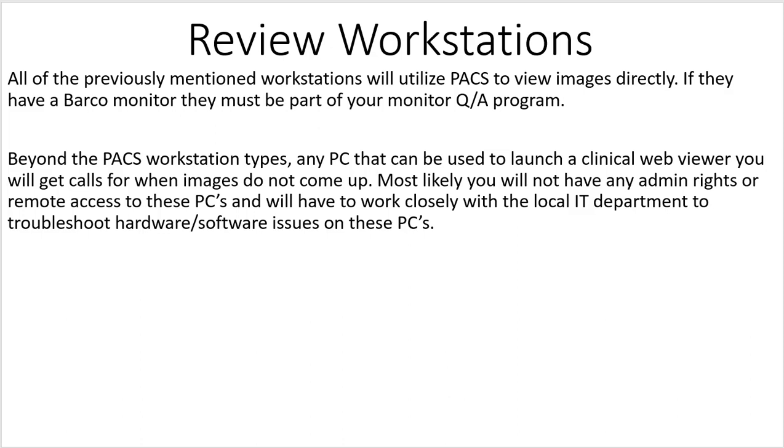And what I'm thinking of here is the doctor's office PC. Right, so he's going to want to bring up images for his patients, and if it's his office in his office building, you're going to have to work with his IT person or whatever local IT department is taking care of that PC.